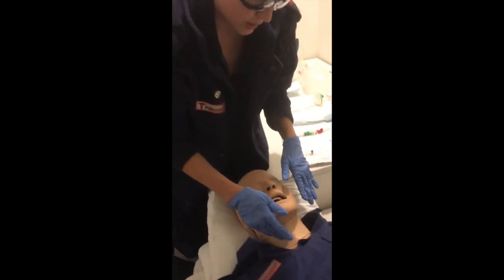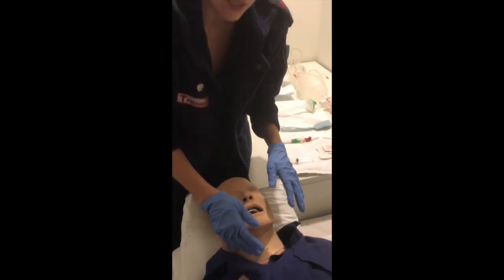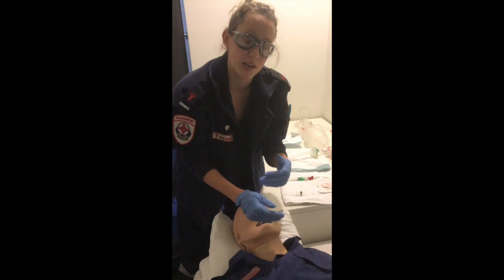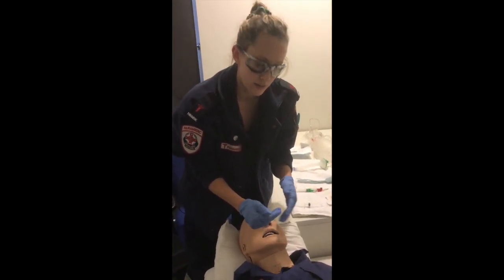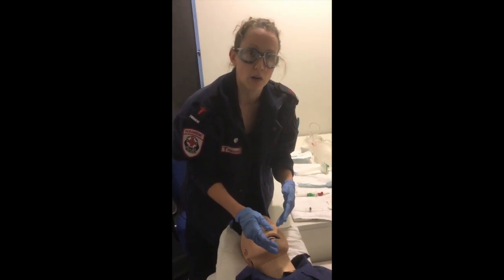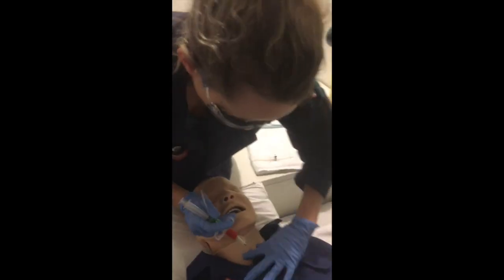Now that we've got our incision, some considerations in this setting: if you have a patient that has a particularly edematous neck, or you have a situation where you can't palpate the membrane, then you may need to consider a bigger and or wider incision, and then physically palpating with your finger to find the membrane prior to the incision. So we've done our incision, we've got our Quick Track 2 device.